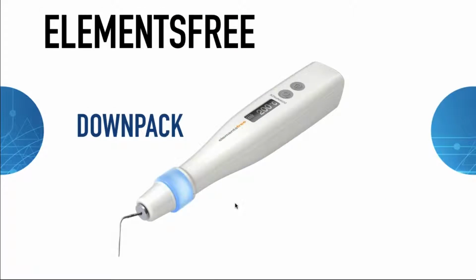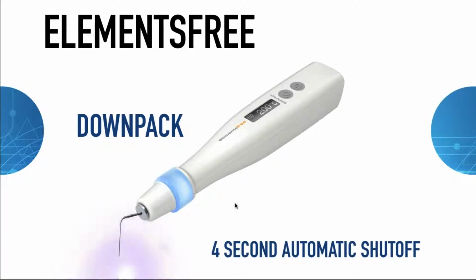The downpack device is nice because, like I said, it's ergonomically favorable. It fits in the palm of your hand quite nicely. You can hold it like a handpiece, and it has a multi-directional activator ring, and a very, very light touch will activate that tip of the heated plugger, and it will activate it for 4 seconds. One of the nice things about it is it has a 4-second automatic shutoff.